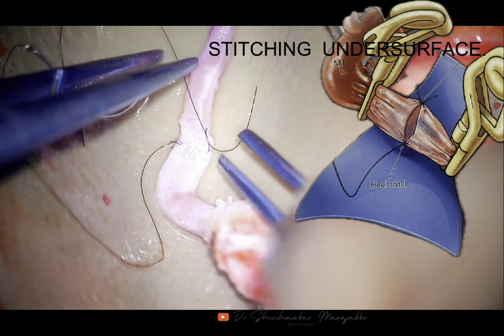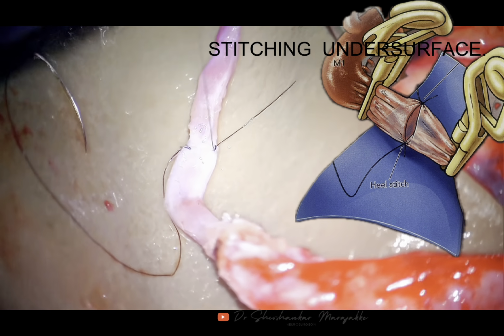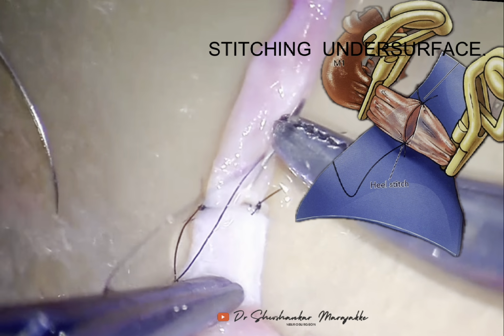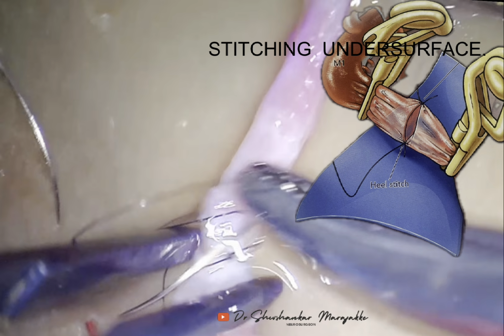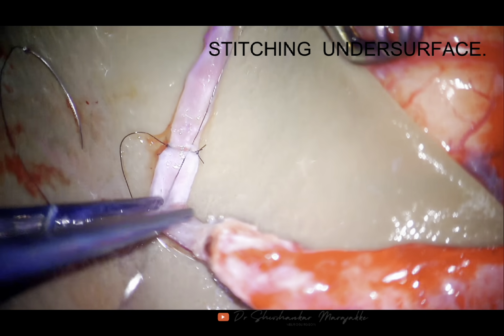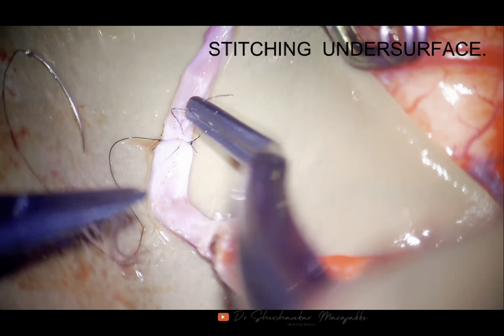It is quite important to understand that anastomosis is a suturing technique that all of us as surgeons practice routinely. But in this case, it goes down to the highest zoom level, and we have to adjust to very small suture material like 10-0 and very small instruments.